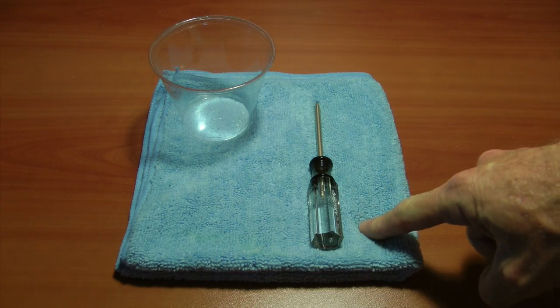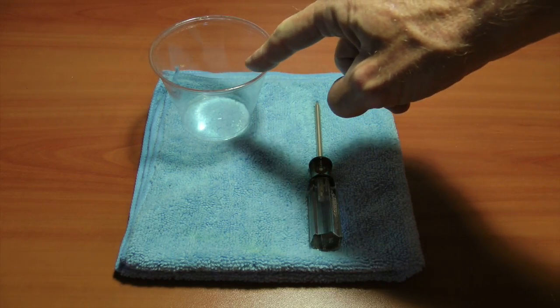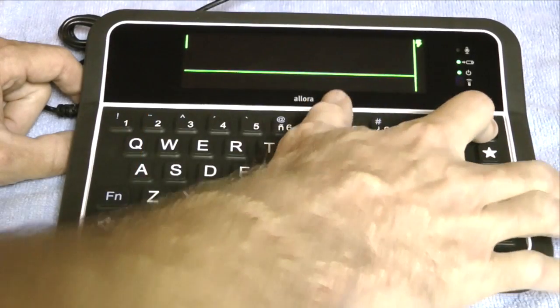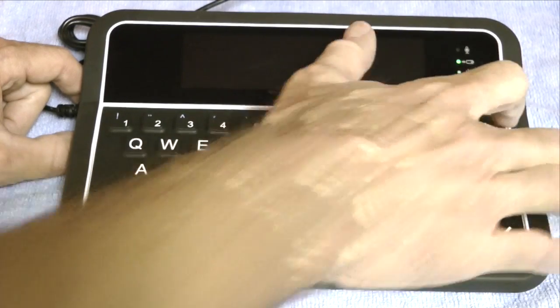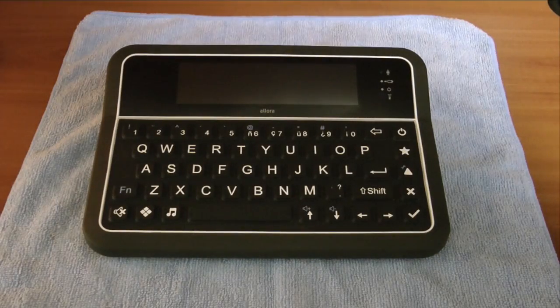You'll need a clean cloth or towel, a Torx number 10 screwdriver, a container to hold the battery cover screws, and a new Allora 2 battery. Turn off the Allora 2 with the on-off key. Make sure the Allora 2 is not in standby mode. Unplug the Allora 2. You'll need to turn the Allora 2 over to access the battery compartment.